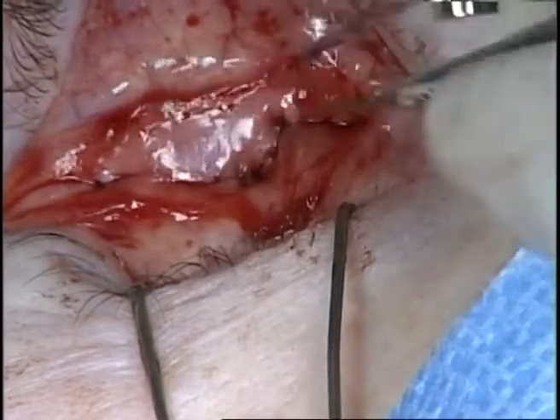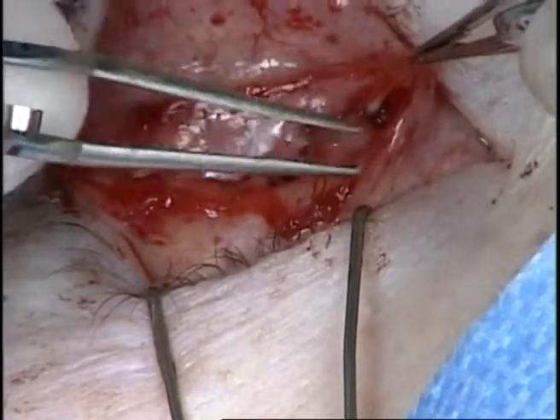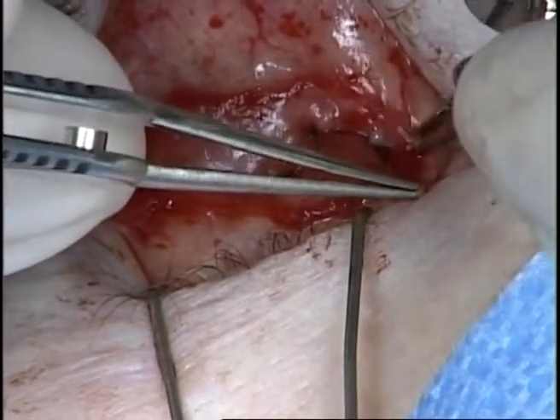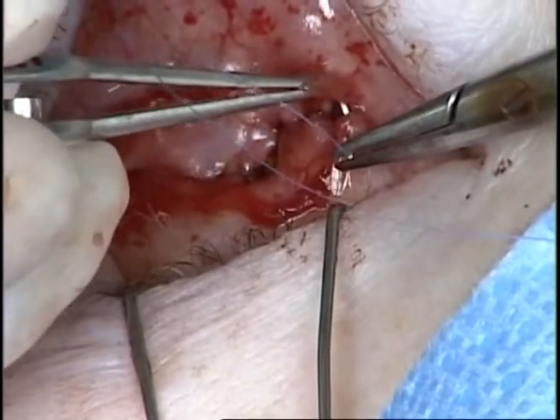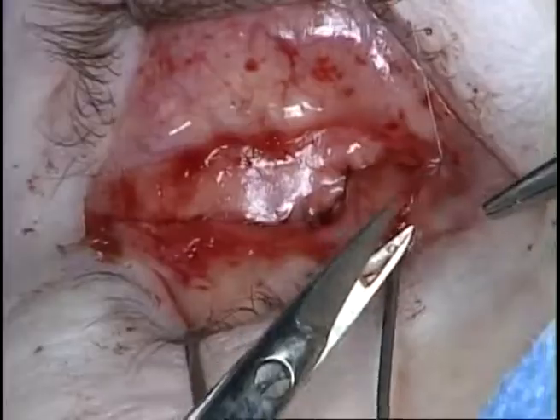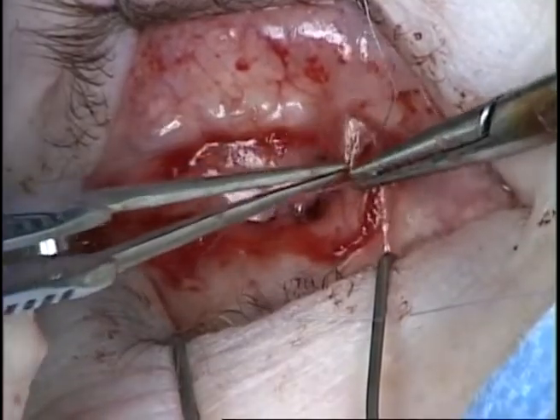The edges of the conjunctiva are then identified and the conjunctiva is closed with a running 7-0 Vicryl suture. It is important to ensure that the conjunctival edges are not buried in the closure to prevent inclusion cyst formation and future implant exposure.